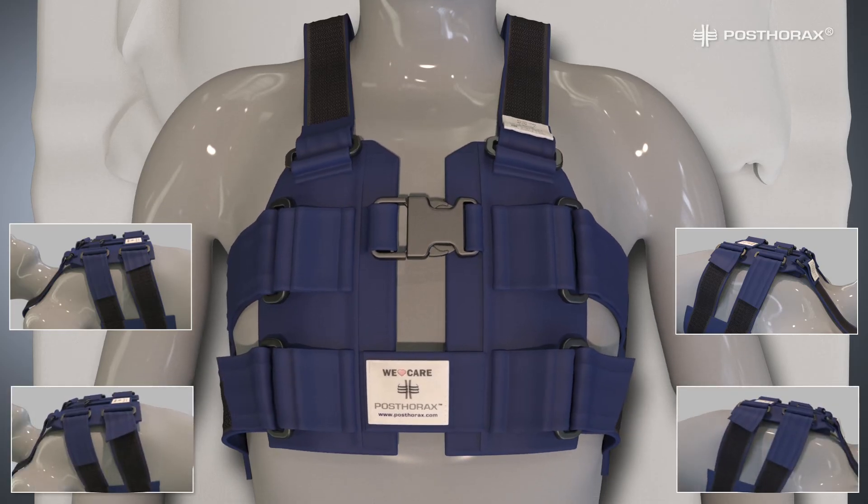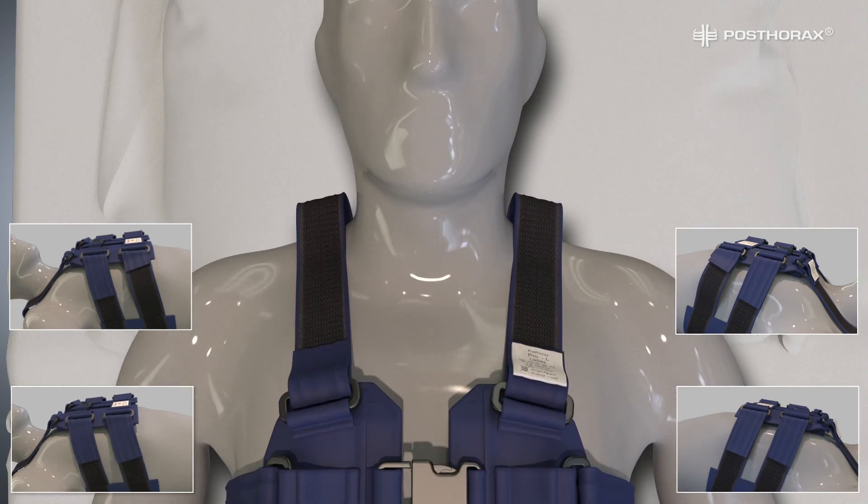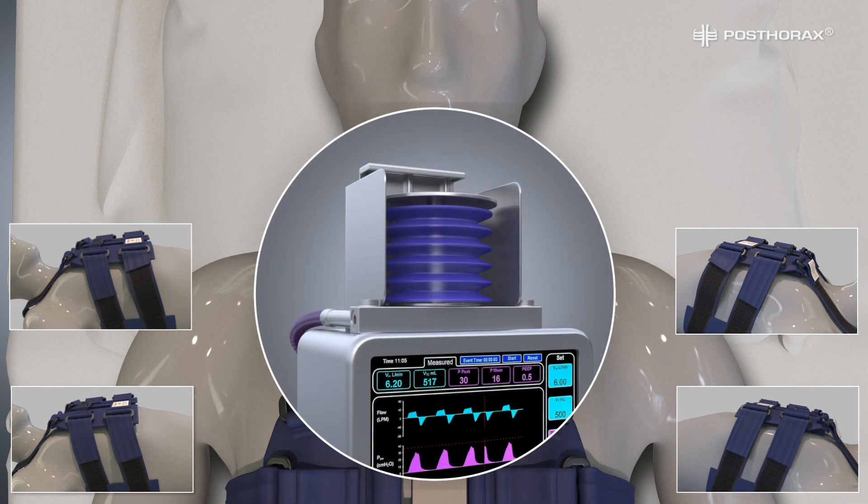Repeat the same procedure with the lower side straps. Note: if the patient is under mechanical ventilation, follow the machine's breathing cycle when closing each set of side straps.